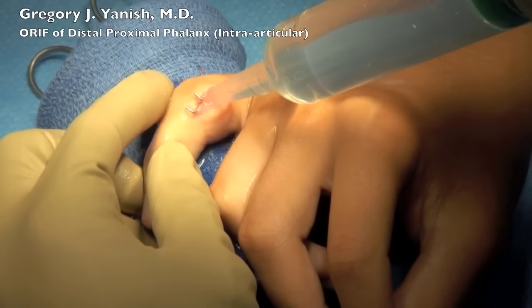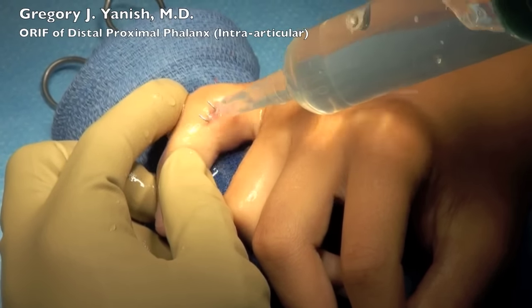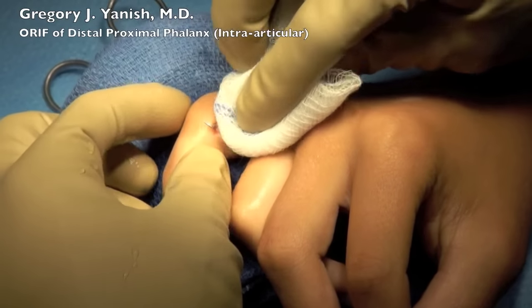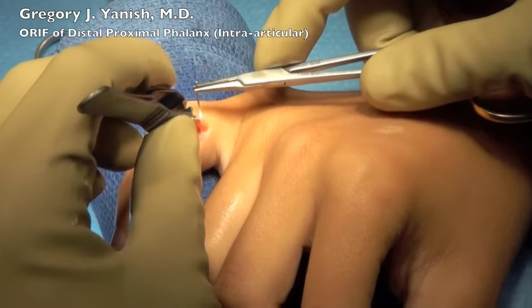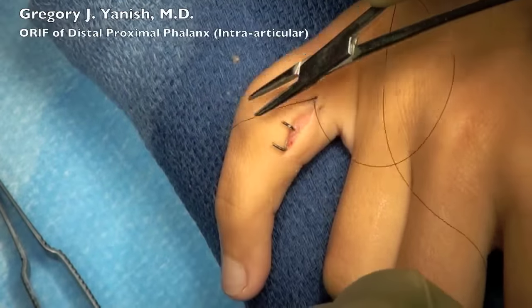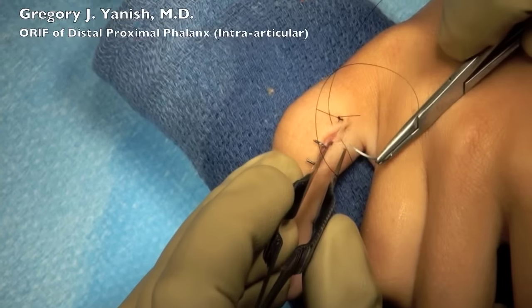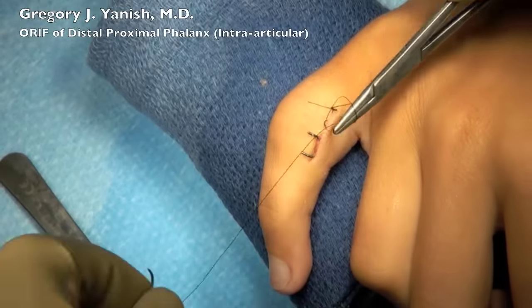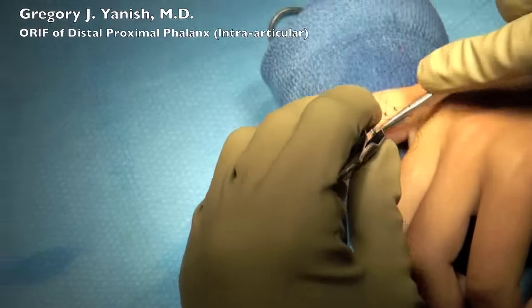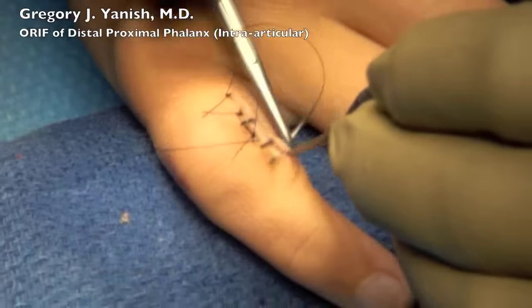The wound is irrigated with saline. The joint capsule is repaired with absorbable suture, and the wound is then closed in layers. This is the final portion of the closure, which is just the skin, being closed with 5-0 nylon suture in a horizontal mattress fashion. Typically with pinning procedures an incision is unnecessary; however, in this patient's circumstance there was a significant delay in presentation, therefore this required opening of the fracture site and removing the bone callus.